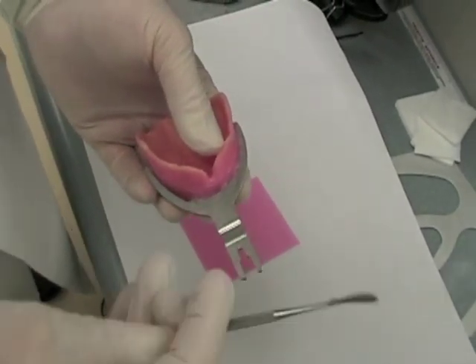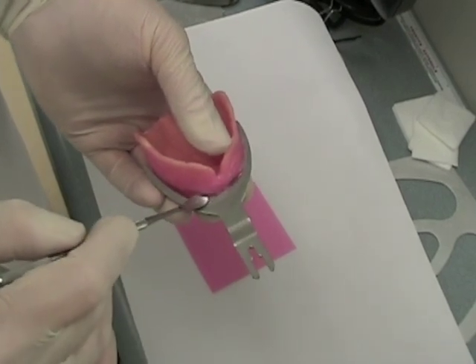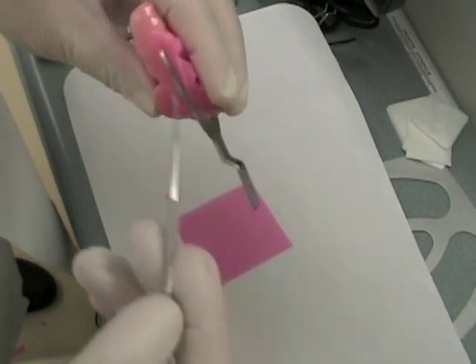You don't want the wax rim or the record base separating from the bite fork when you're making your face bow transfer. Seal that well so that it can't move in the wax rim.